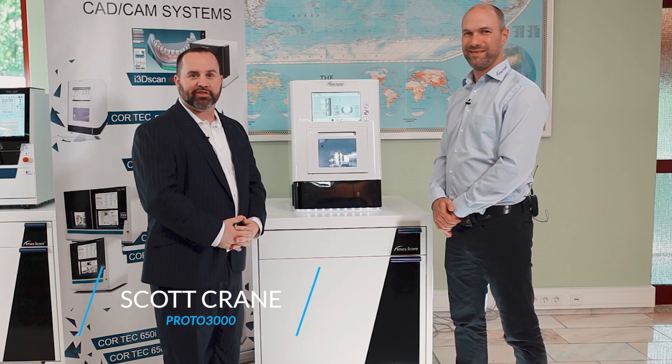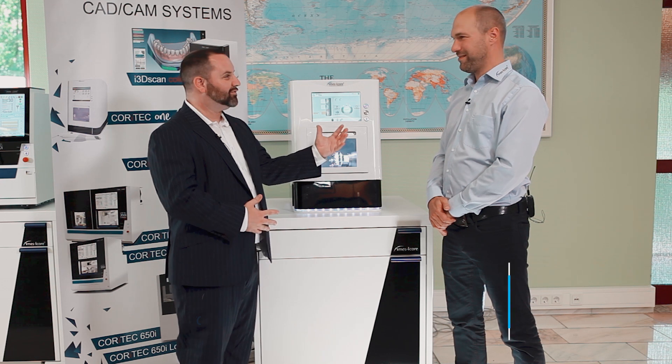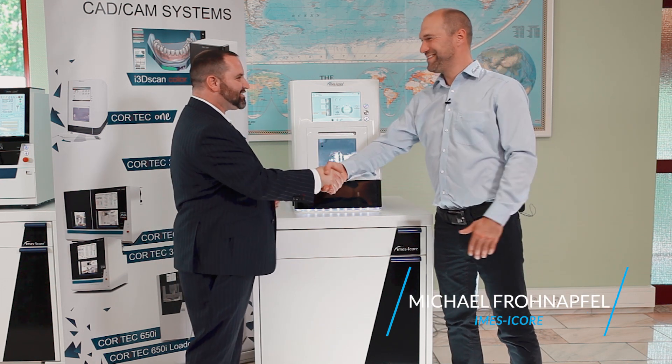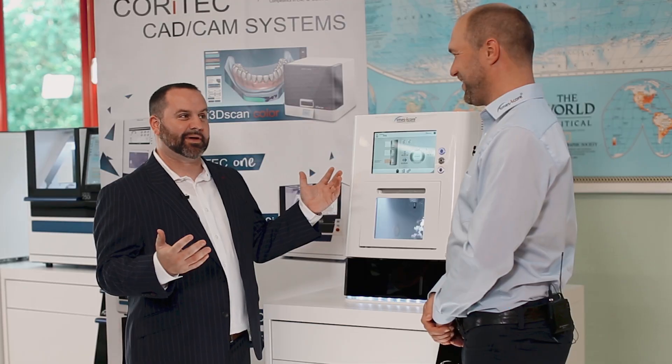Hello everybody, it's Scott Kram with Proto 3000. I'm up here in Germany at MSI Core with Michael. Good to see you. I am here with the CoreTec 1. Tell us about this.